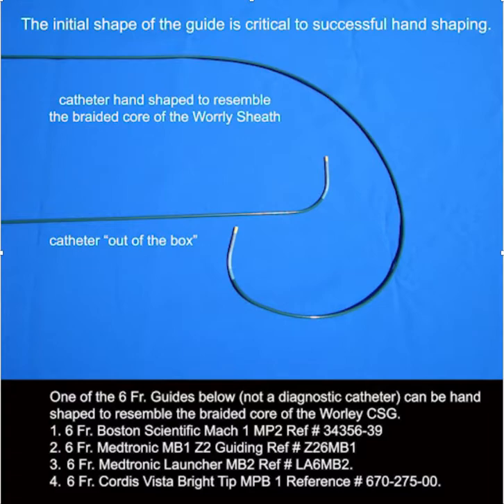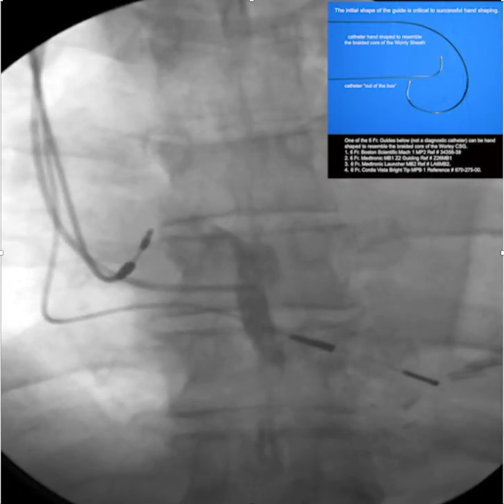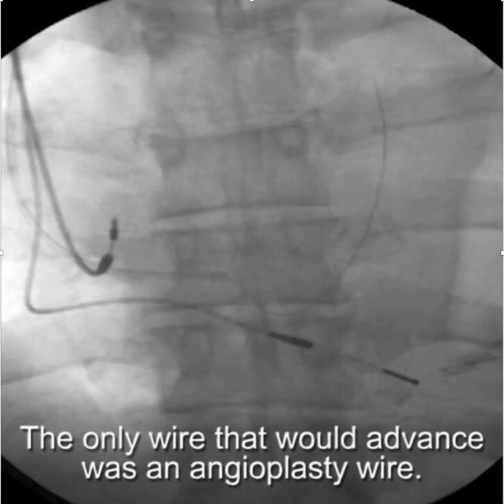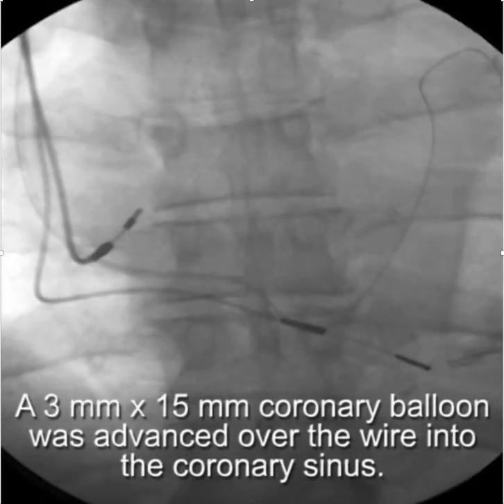If you start with anything other than this it's difficult to create the proper shape. Using that hand-shaped multi-purpose catheter I was able to balance on the coronary sinus, but couldn't advance a wire other than an angioplasty wire. All the more stable wires knocked the tip of the catheter off the CS.